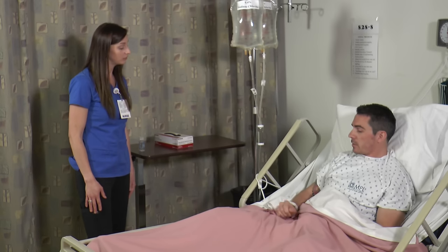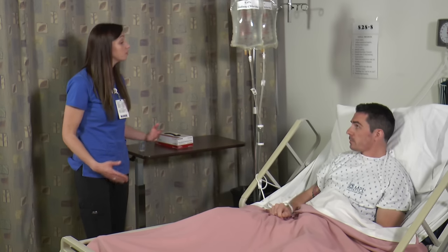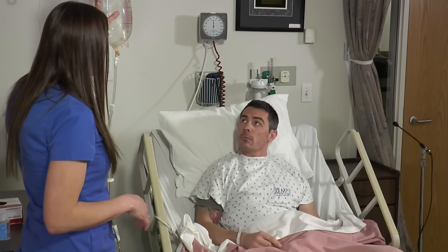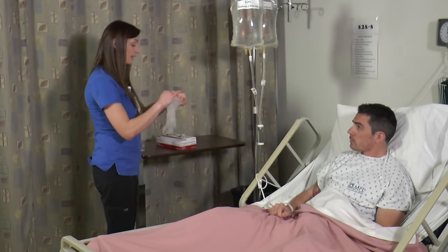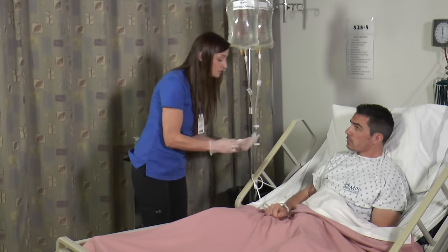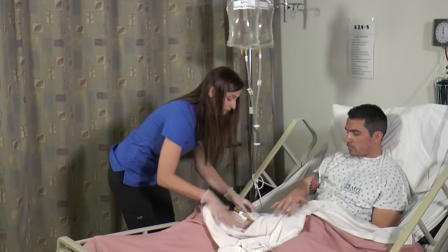I'm a little bit unclear as to exactly what this catheter is for and why it has these huge bags attached to it. Okay, so that's a really good question. After somebody has had a transurethral resection of the prostate, they often receive continuous bladder irrigation, and that's what this setup is. It's also referred to as a three-way catheter irrigation system, okay? And the reason we call it that is because the catheter that you currently have has three channels, all right? So I'm going to show you these three channels and what each of them are for, okay?